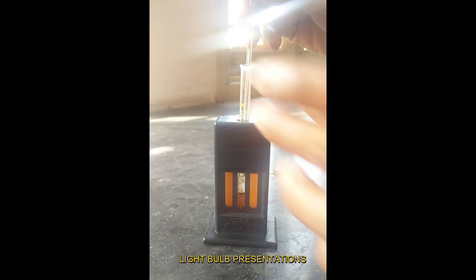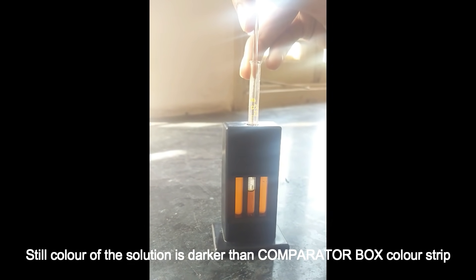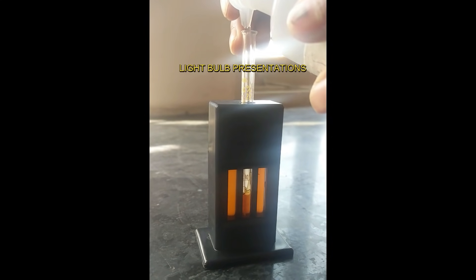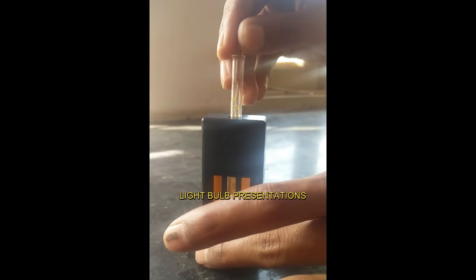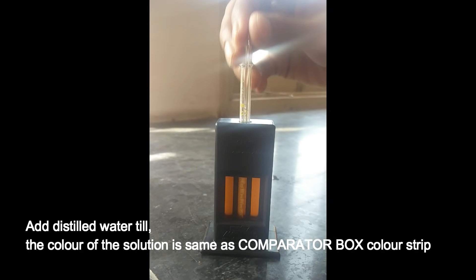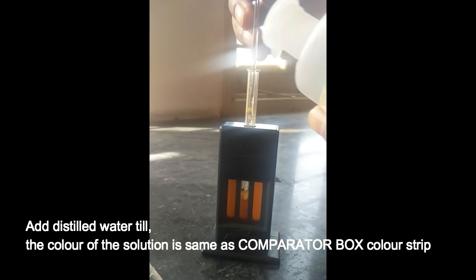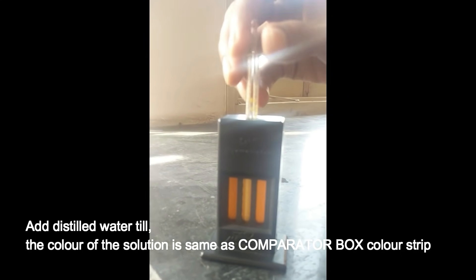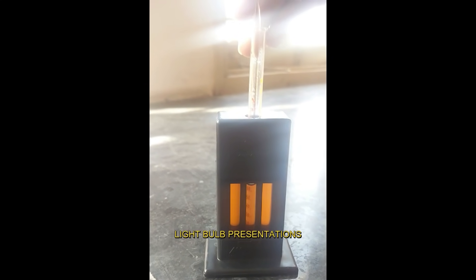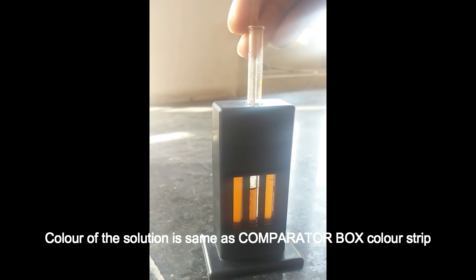When you compare the color of the solution with that of the standard comparator box color strip, keep the stirrer above the solution but do not take it out. If the stirrer is taken out of the tube, the solution sticking to it will be lost and will give a false low result. If the stirrer remains in the solution, the color of the solution becomes lighter. Comparison should always be done by holding the comparator box with the hemoglobinometer tube at eye level, with the stirrer slightly lifted above the solution but not taken out of the tube.